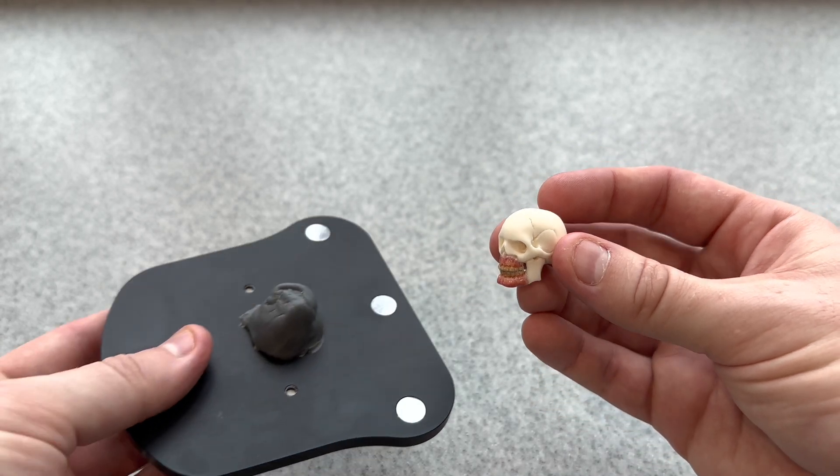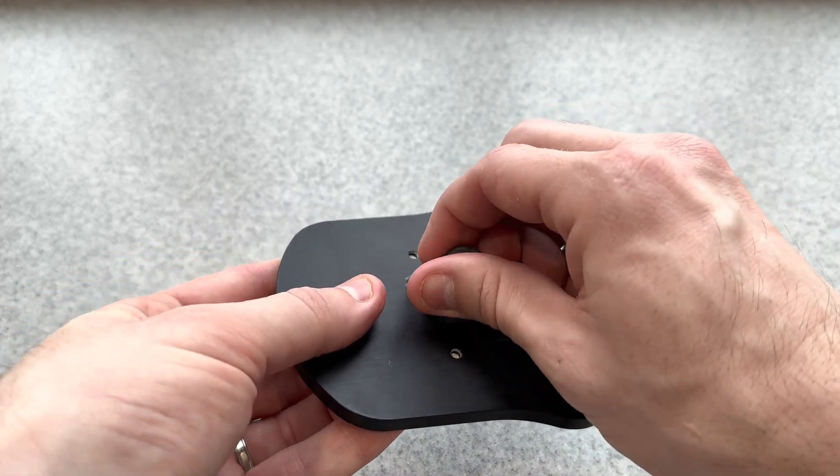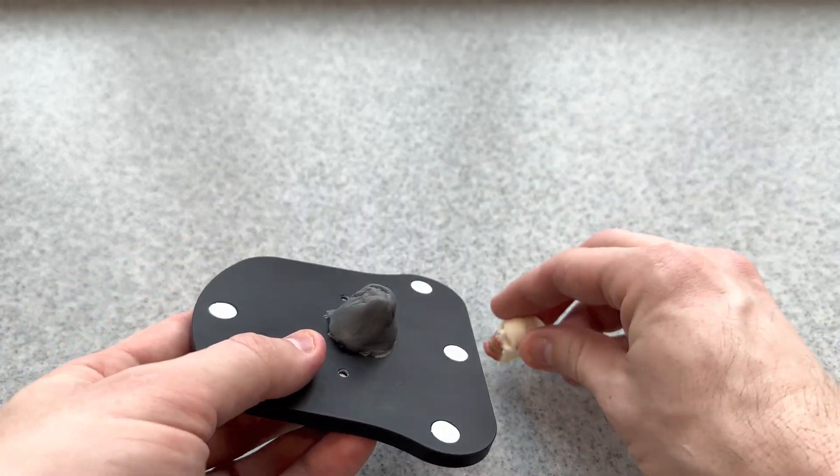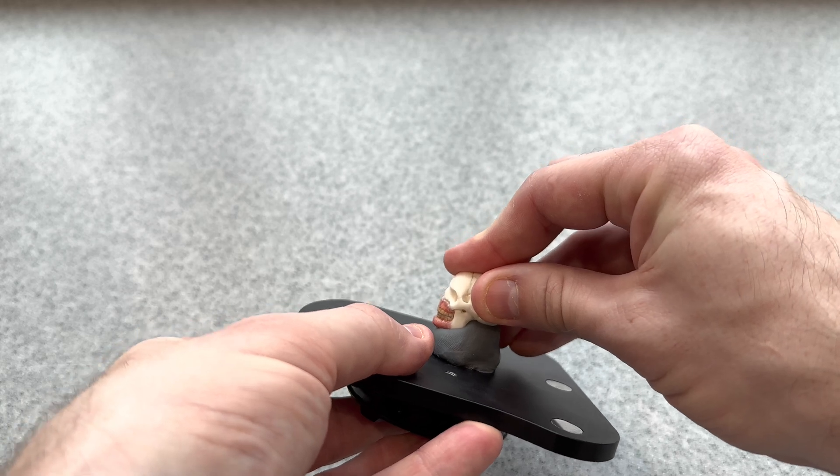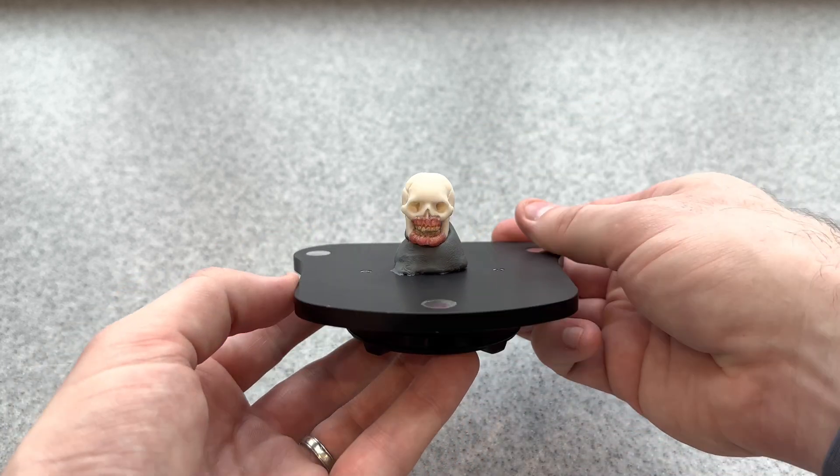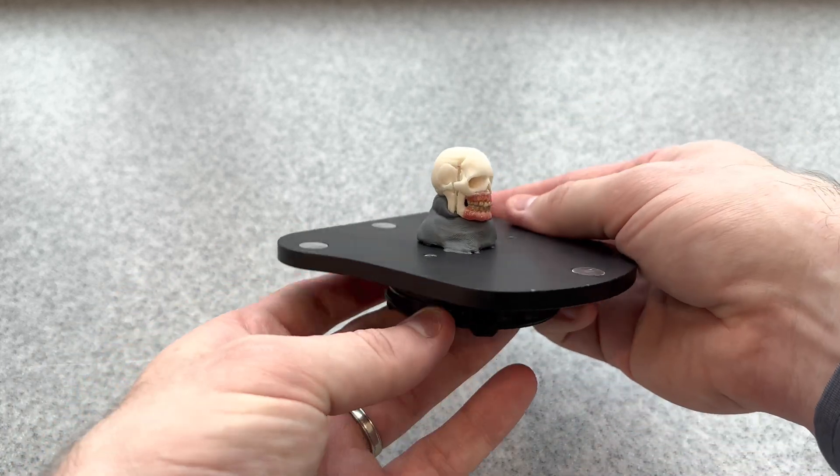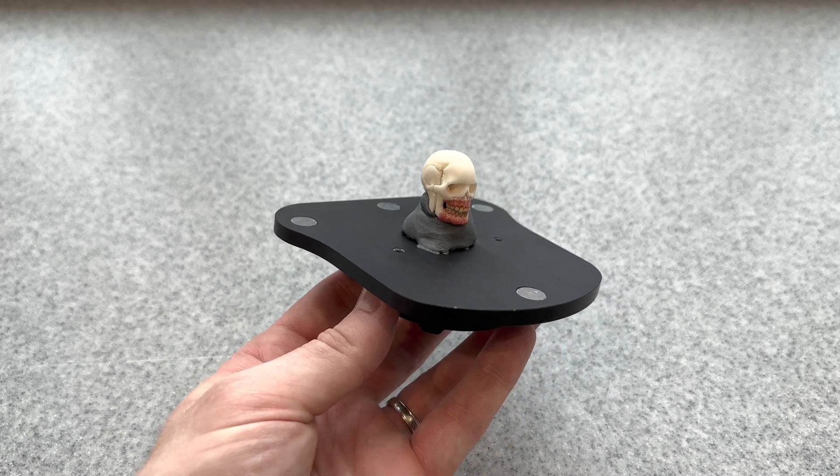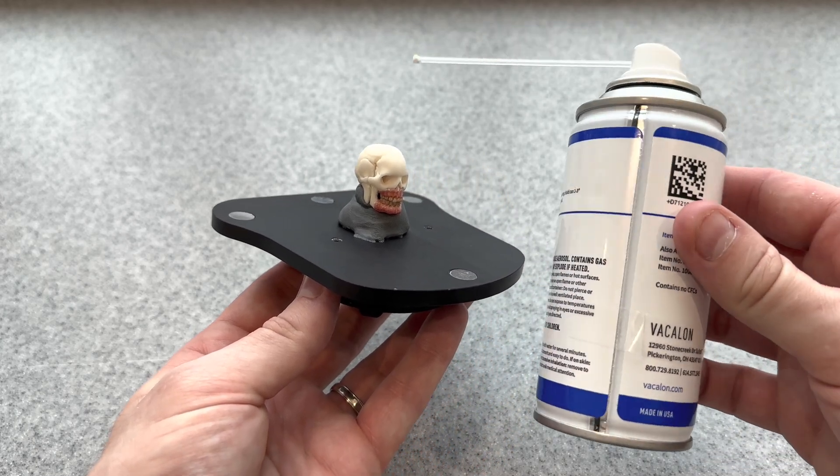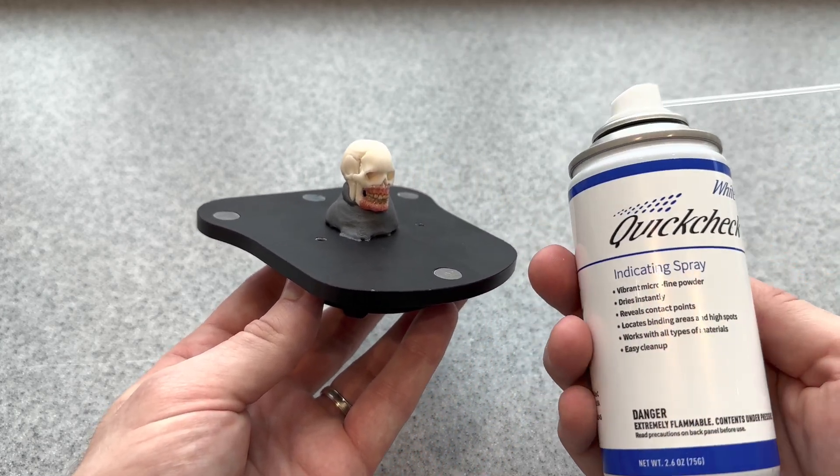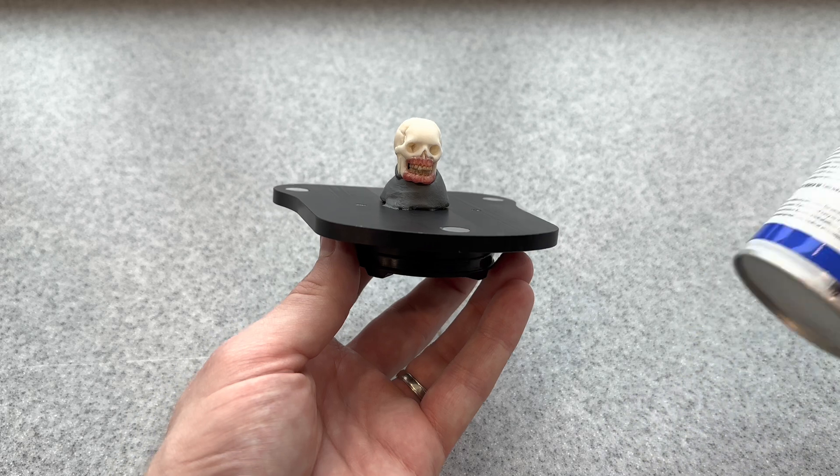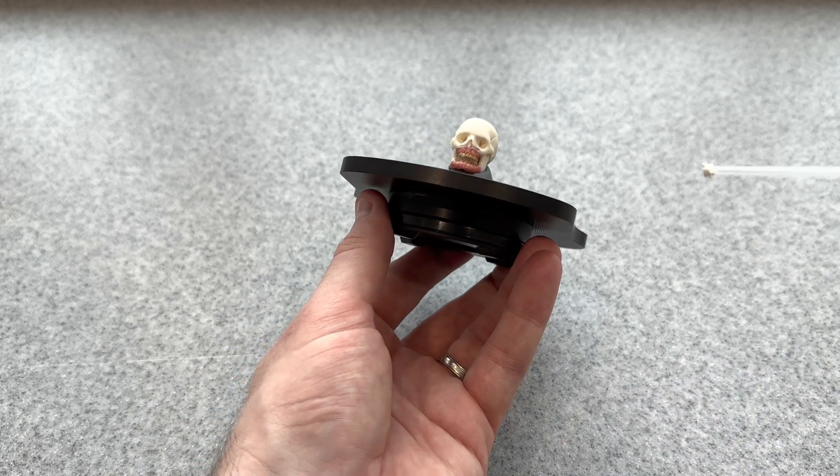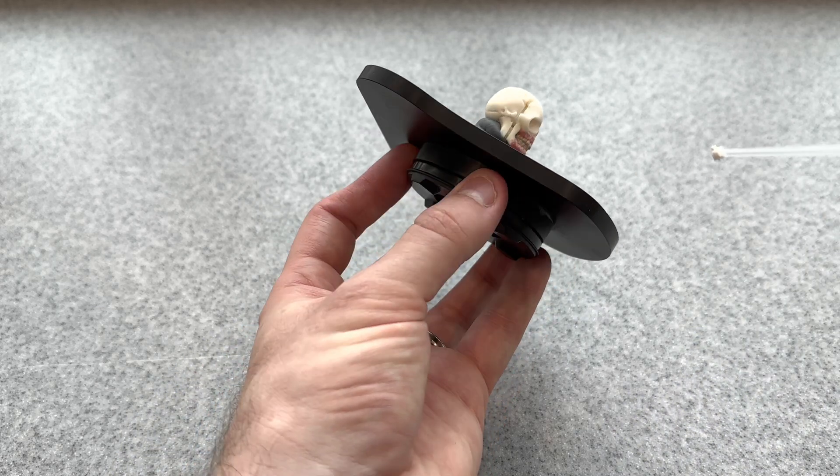We're going to put this onto the putty of the Universal Objects Holder. Since the teeth have a shine to them, we need to use a white powder spray to cover that. Shake your bottle and spray it on with a thin coat so the shine is no longer there.